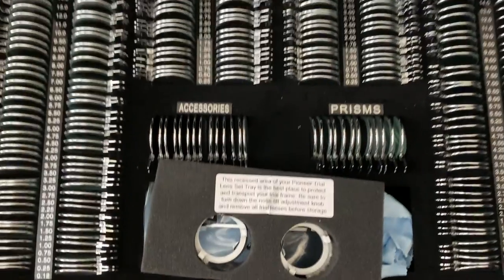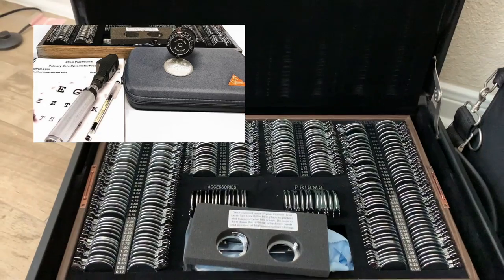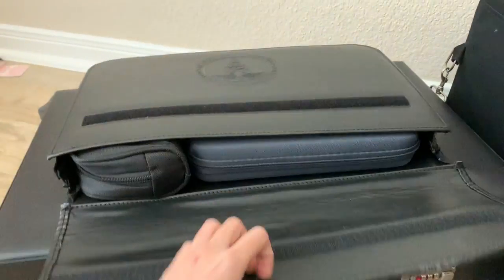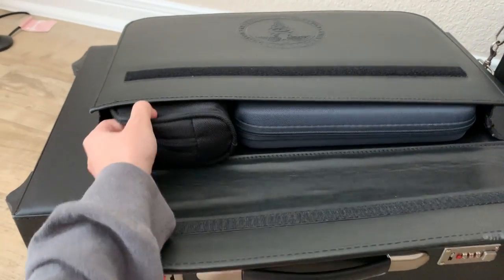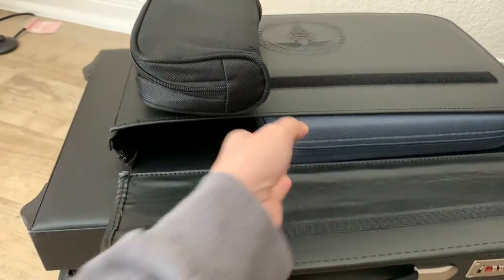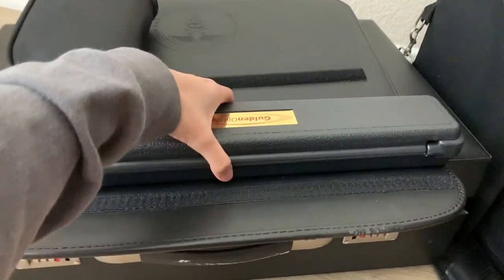Here's an overview: we have our concave spheres, our cylinders, our convex spheres, and some prisms in the lens kit. What's cool is that you can detach the case. In the next pocket we have some extra blood pressure cuffs, and here are the loose prisms.